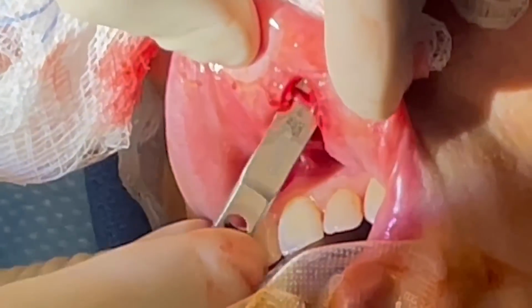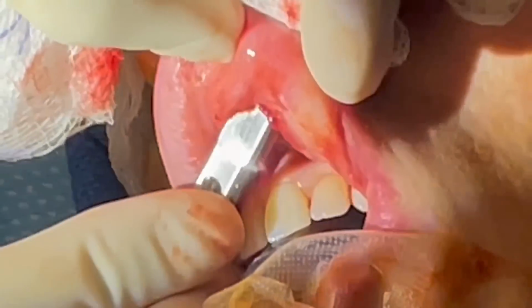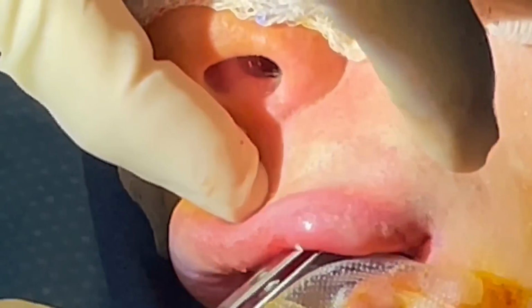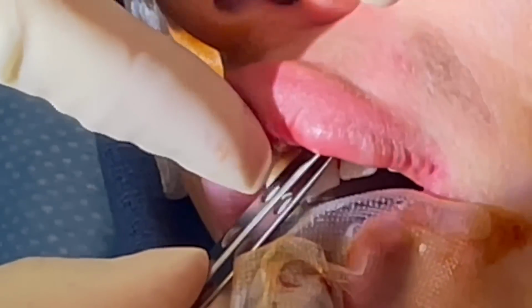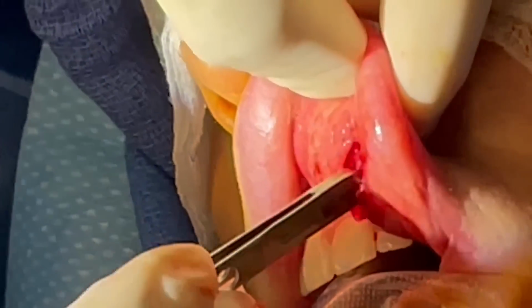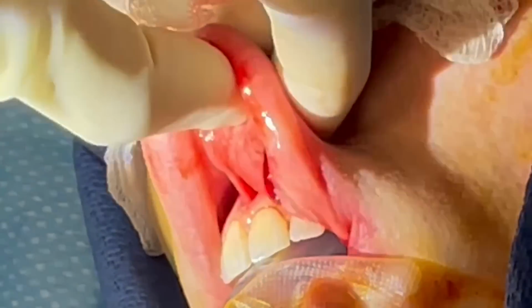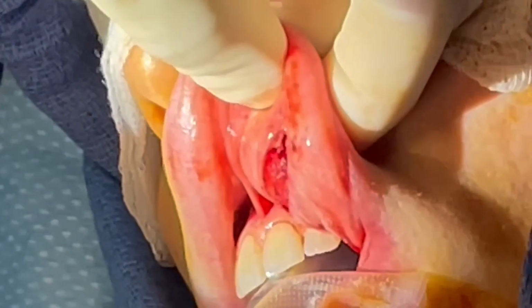So now when I put this underneath, right here, you can see all over. And since we didn't cut the punctum and get the thing, we had to really scrape off the sac wall, the epithelium on the inside, very carefully, which we did. And looking in the deep hole there, there were no remnants. So now we can carefully stitch it and get done.